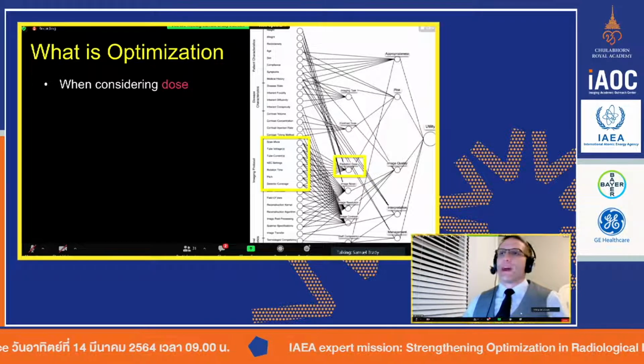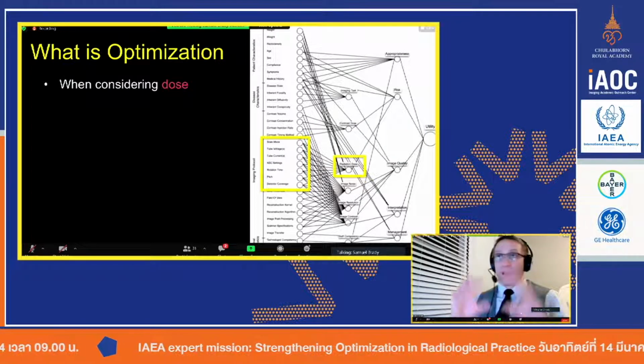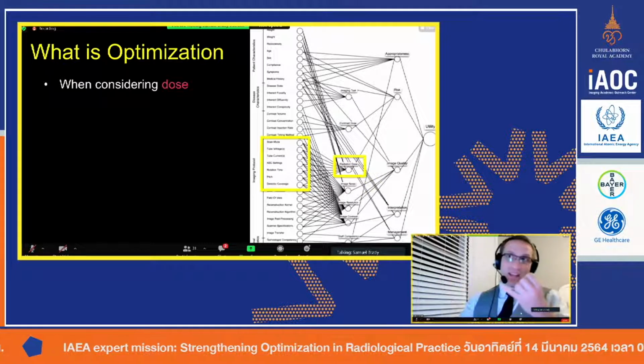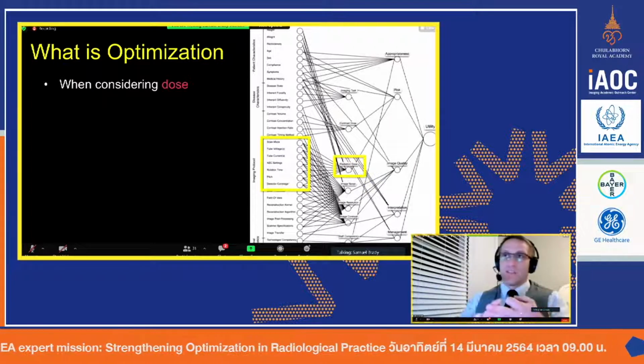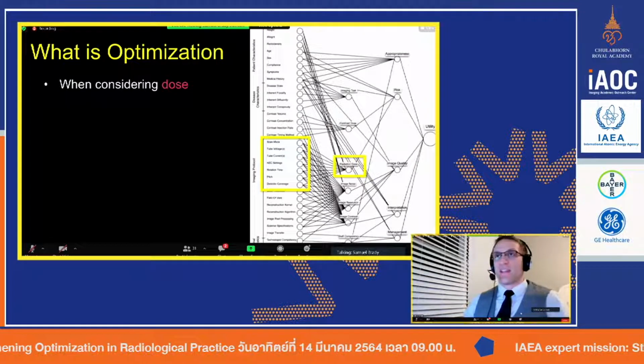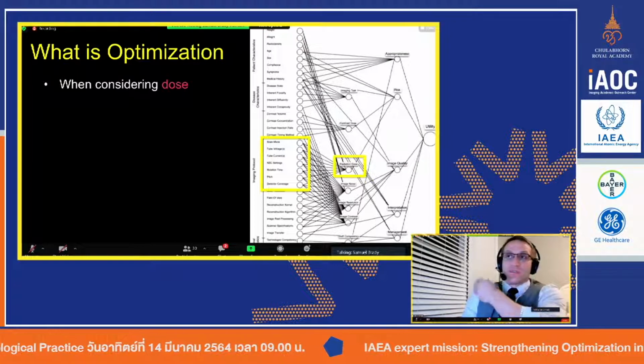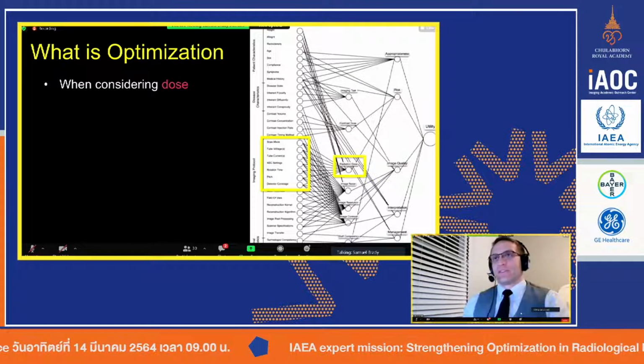So we had a lot of problems with our C-spines for a long time. And the biggest fix, we tried everything. We tried kVs, we tried higher mAs, we tried everything. The biggest change was when we just started imaging from the bottom up. And that's just because the system can reduce the dose from the shoulder to the neck really quick versus flipping it around.